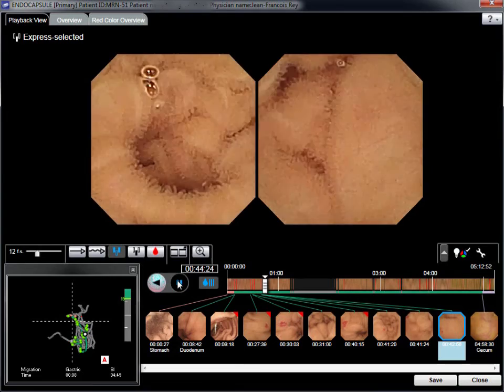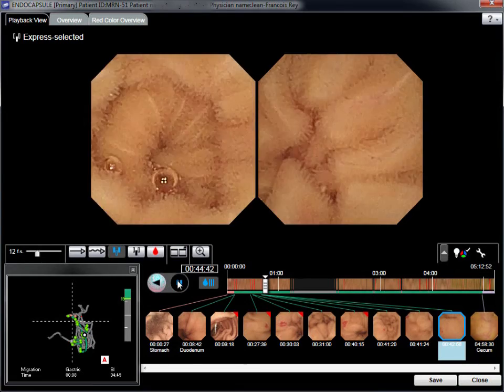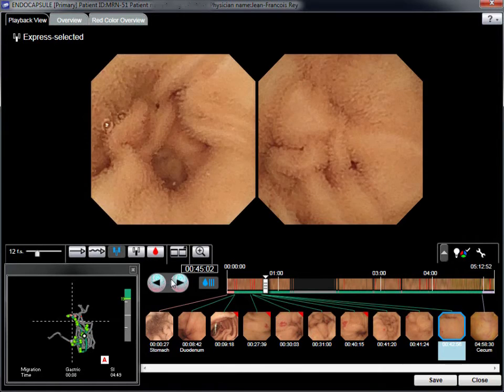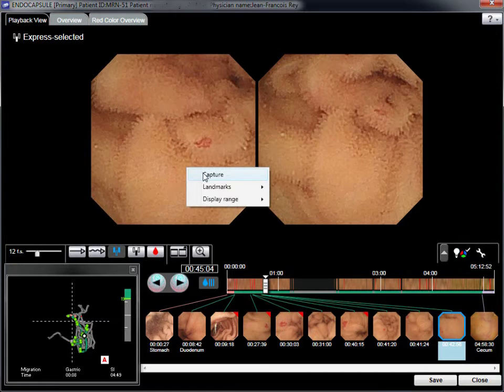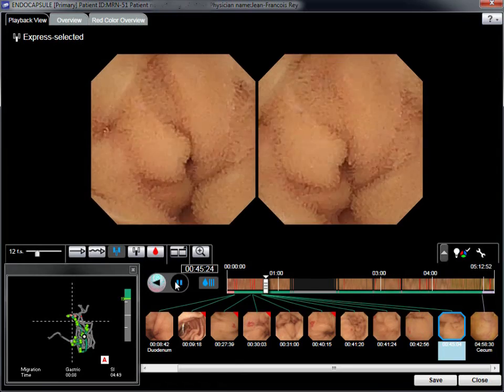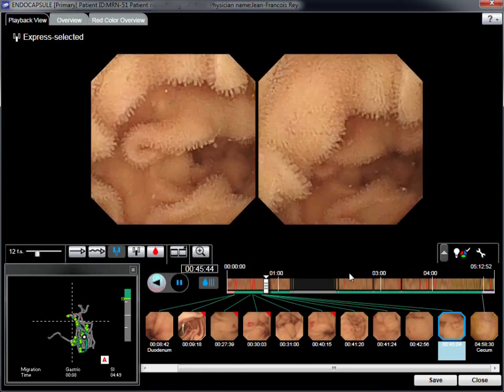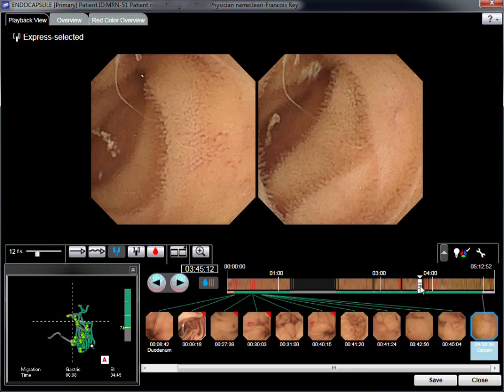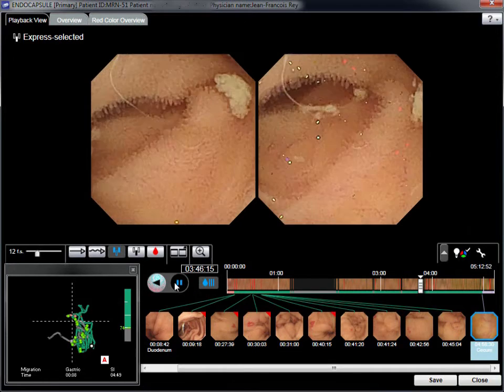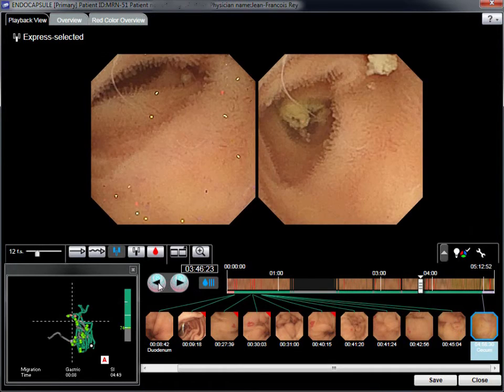Some angiomas are clearly visible, but minor vascular abnormalities are more difficult to identify. Another trick for reviewing video and avoiding eye fatigue is to play the video at various speeds. Artifacts have to be differentiated from real angiomas.